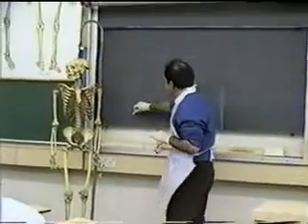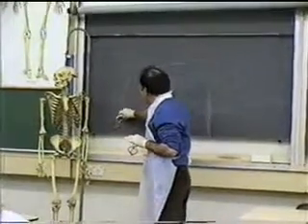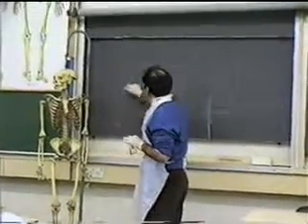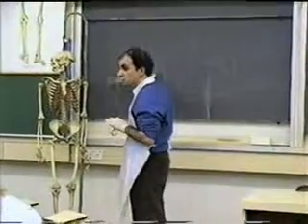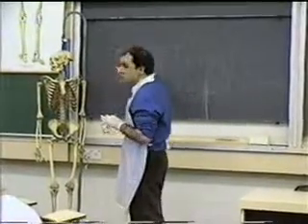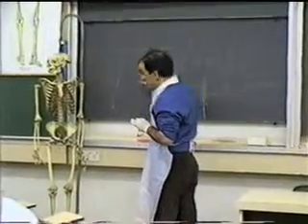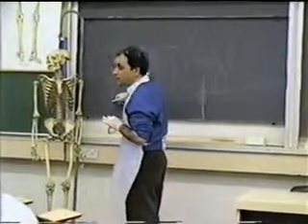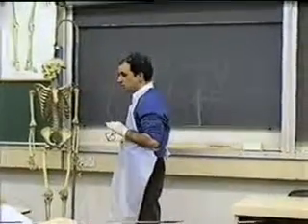So I will start with a lateral osteotomy. I would check the level. I would see the anatomy, because of course this osteotomy is not done into the nasal bones. It is done into the maxilla bone, into the frontal process of the maxilla.